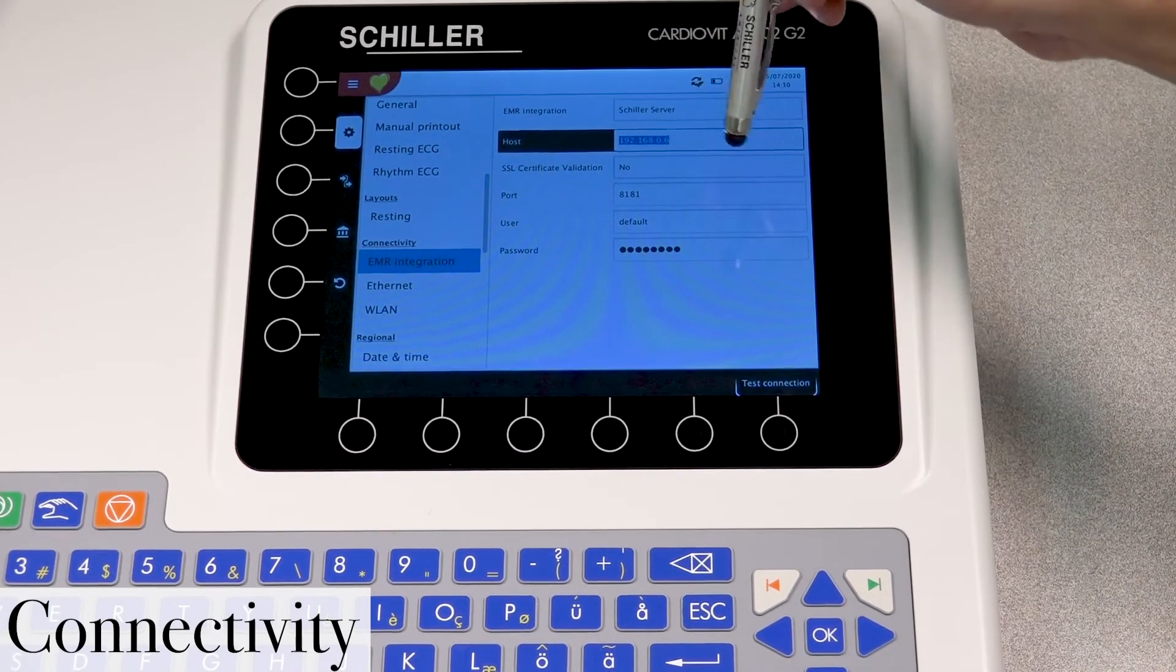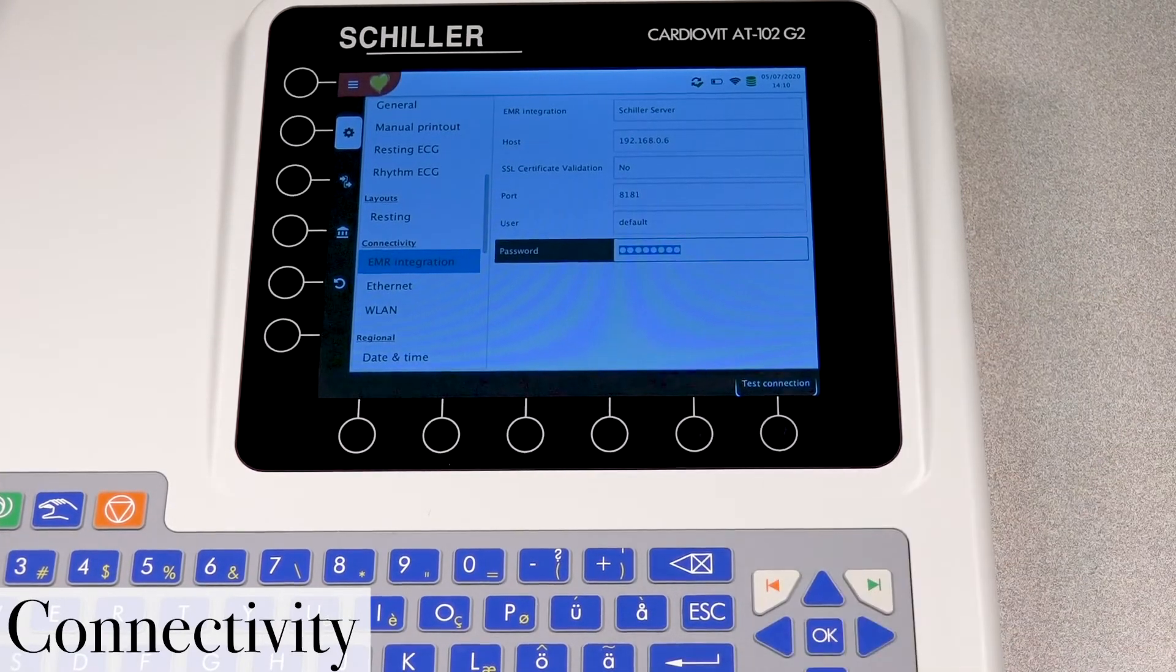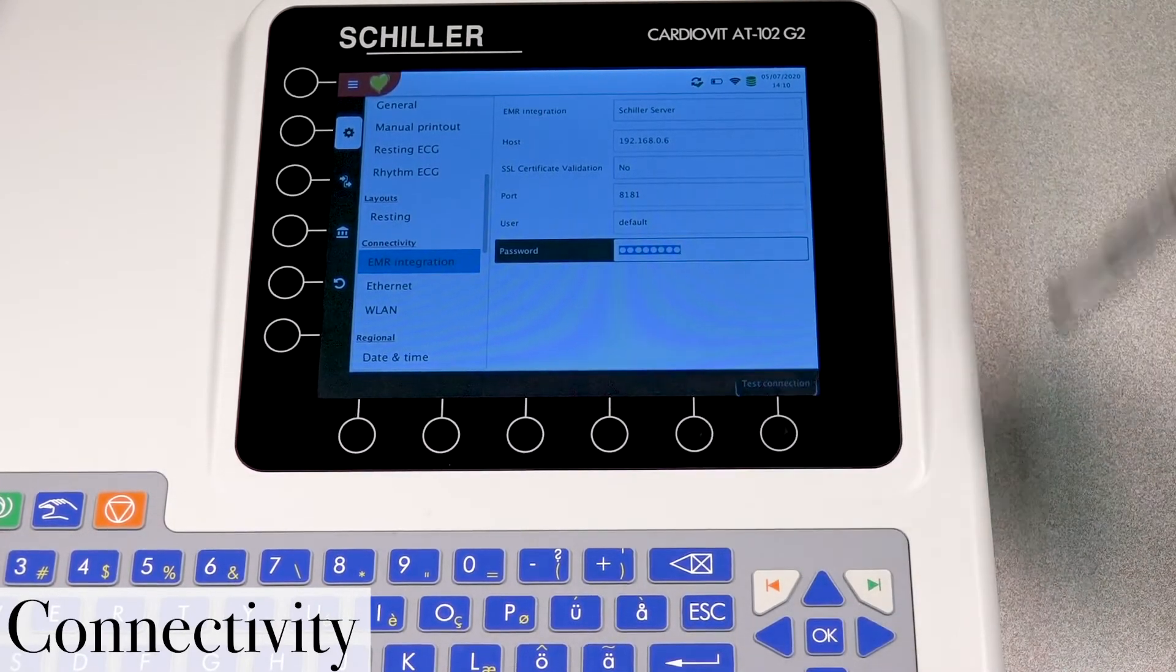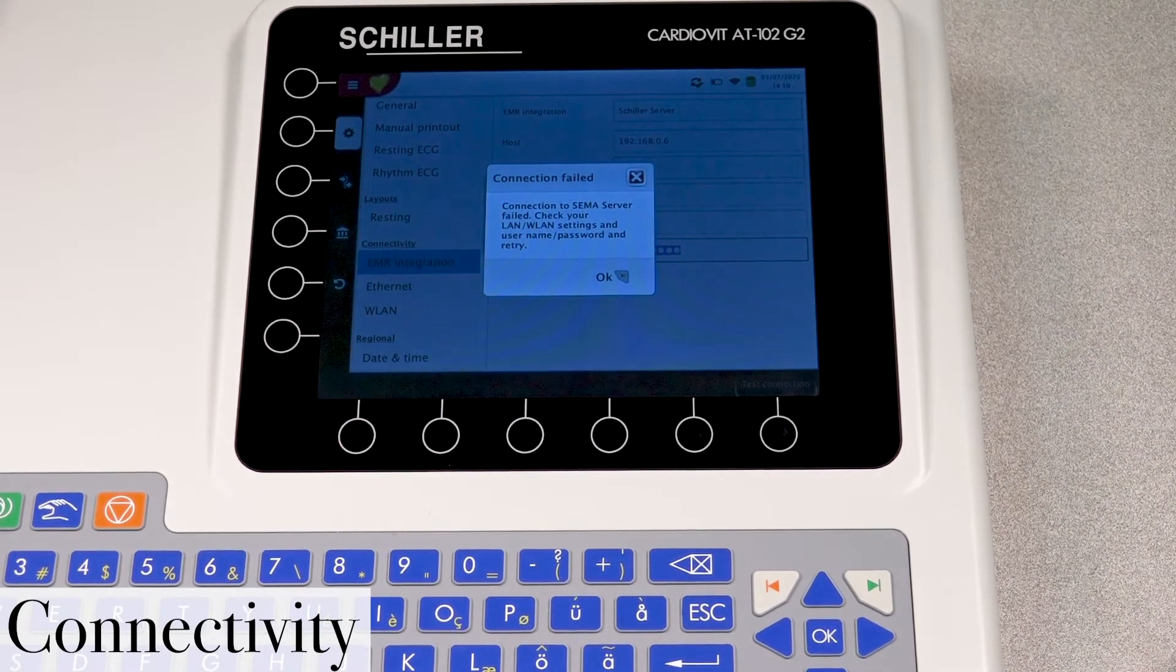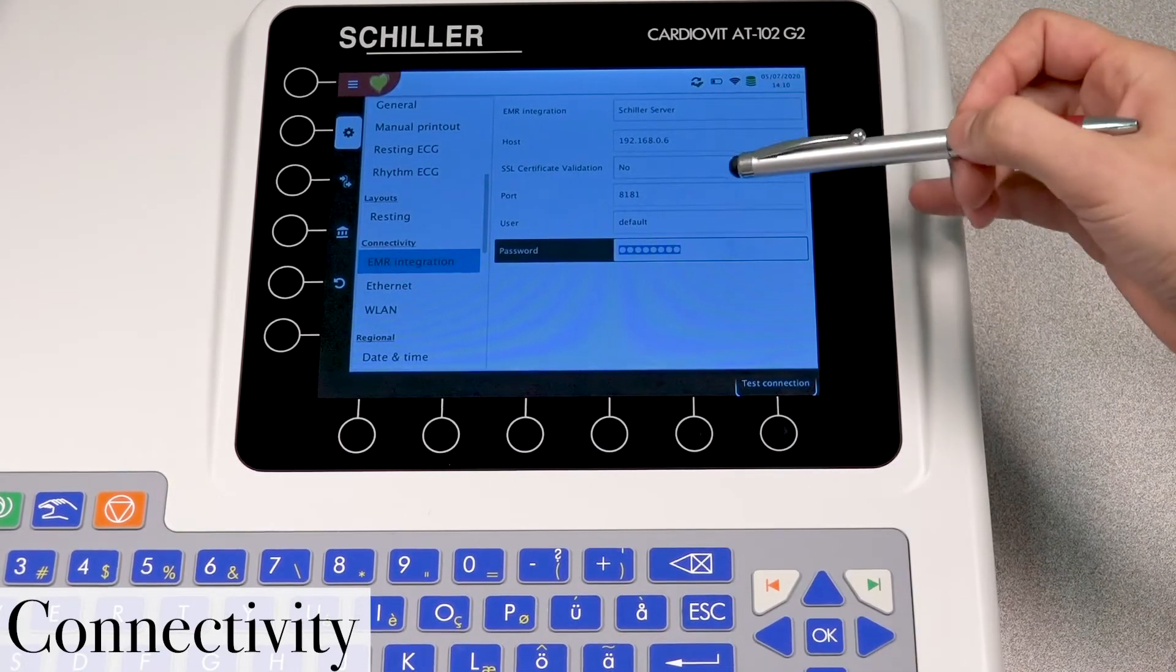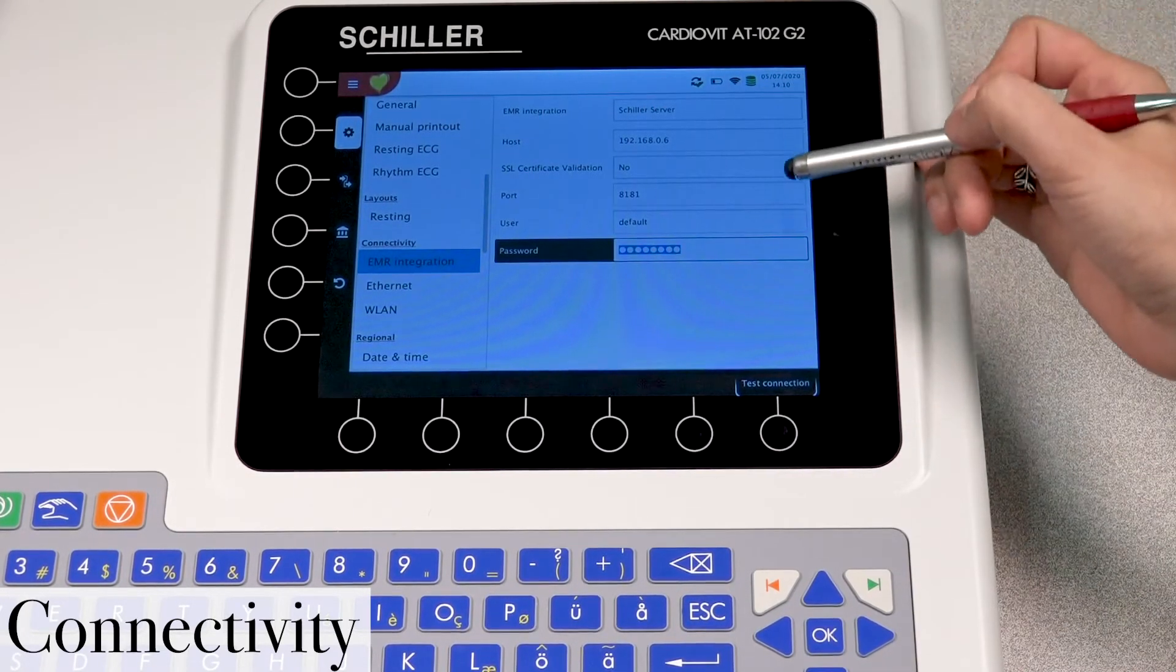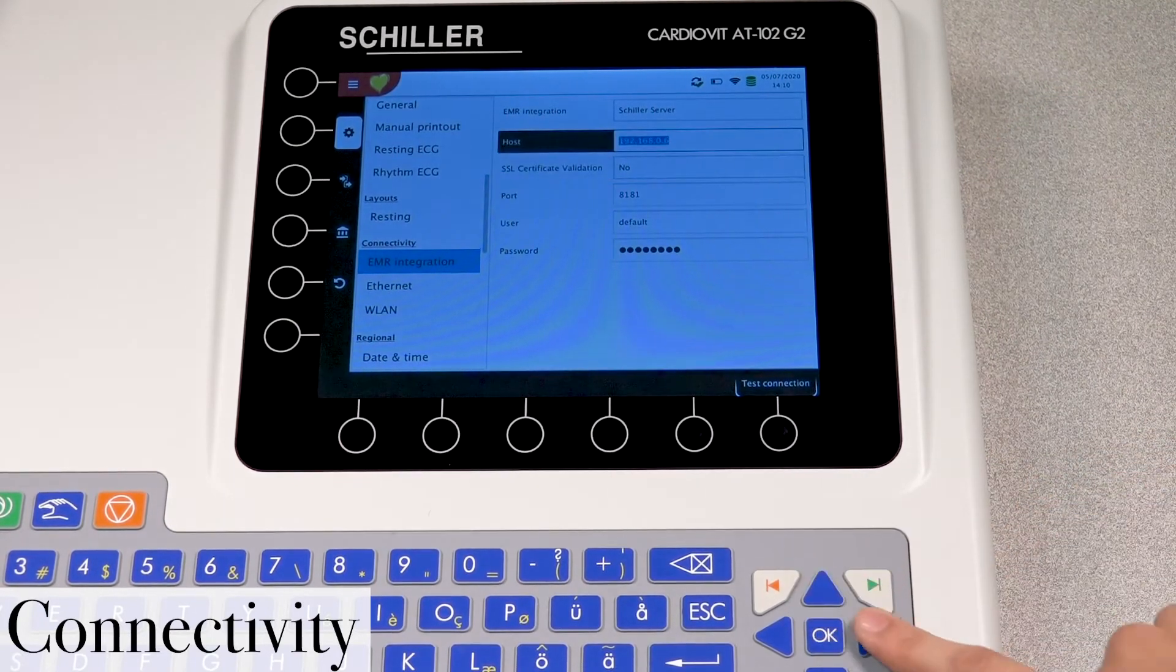So we went ahead, entered the IP address. And our password is entered. Let's go ahead and test the connection. Testing the connection. Well, the connection is actually still failing. So let's go ahead. We're going to press OK, get out of here. And then we have to look again on our information and ensure that everything is inserted properly.